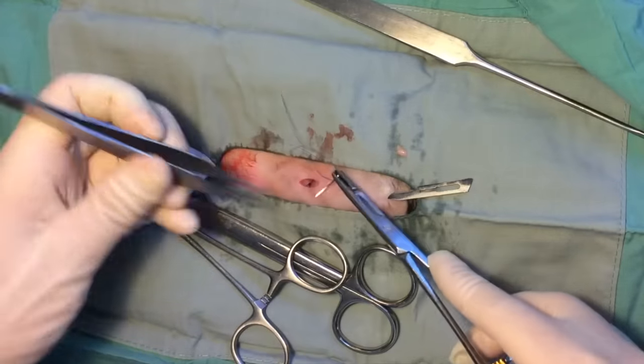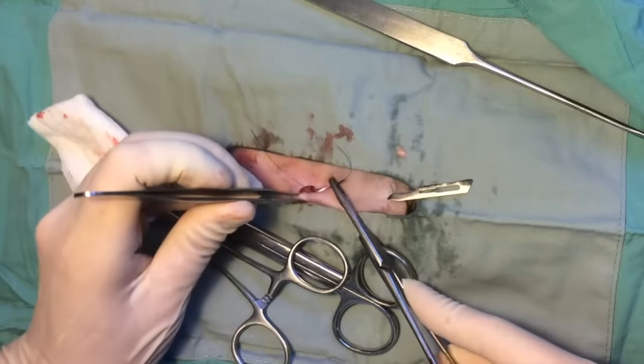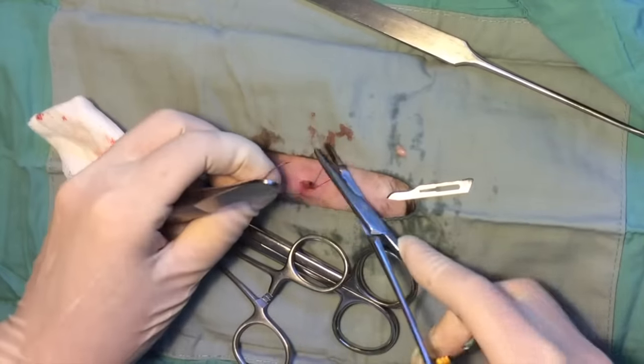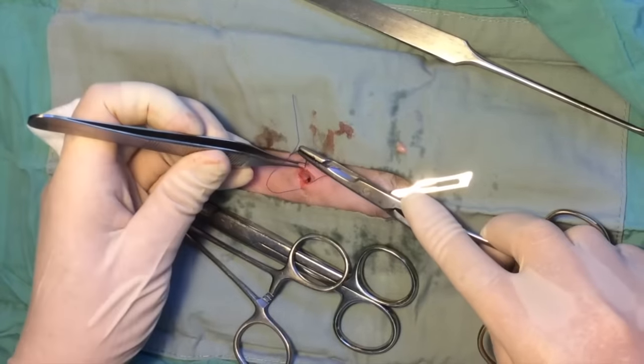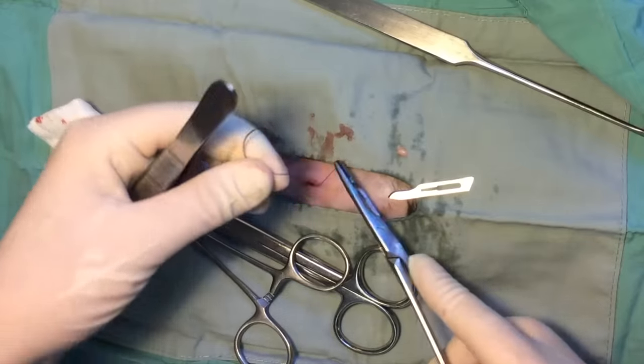A single subcuticular inverted suture is placed to close the incision. The suture is placed deep to shallow, shallow to deep, so that the knot is buried without requiring tacking to the body wall. While tying this suture, care is taken to hold the suture ends parallel to the incision in order to facilitate burying the knot.